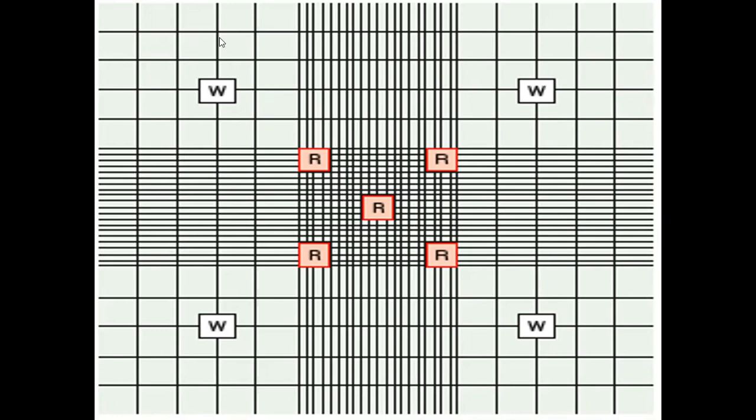This is represented by one chamber. The dilution that you are going to use is 1:20.